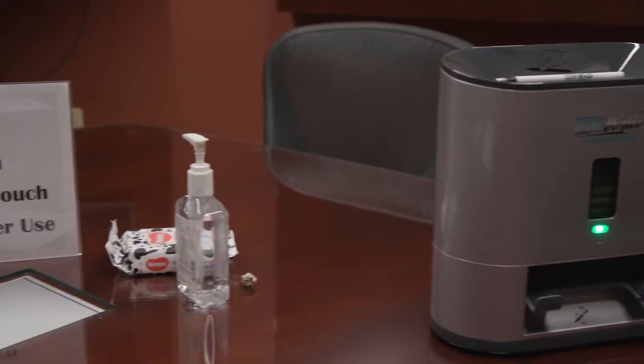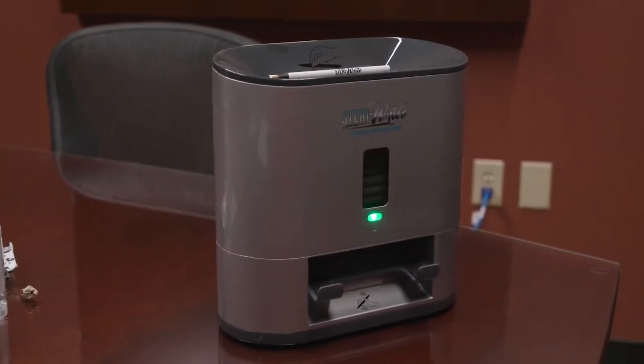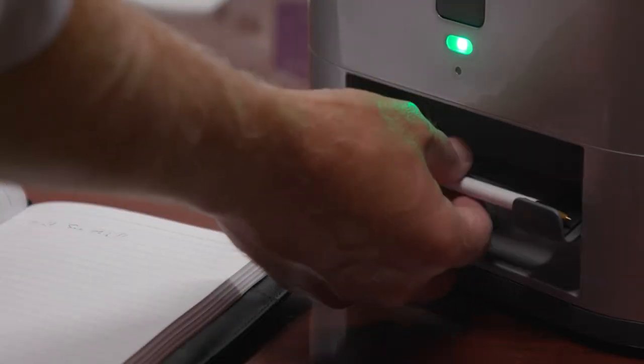Steri-Write is the world's first hands-free writing instrument sanitizer. It delivers the end user a clean, sanitized writing instrument on demand. It utilizes UVC germicidal technology to clean pens and other writing instruments.